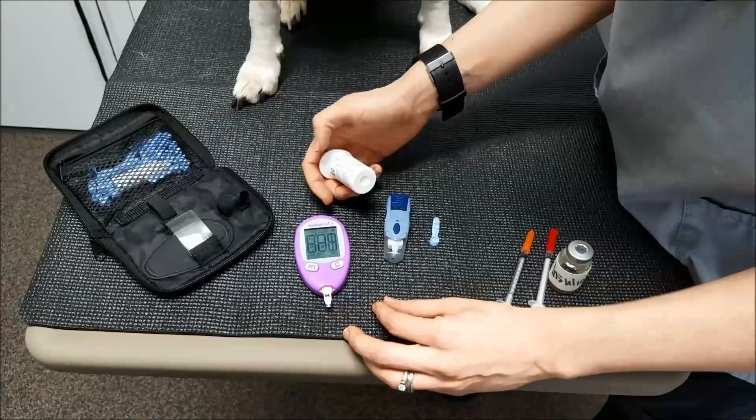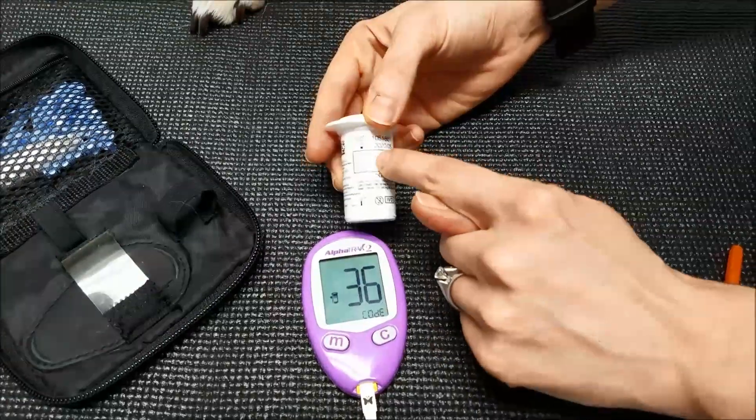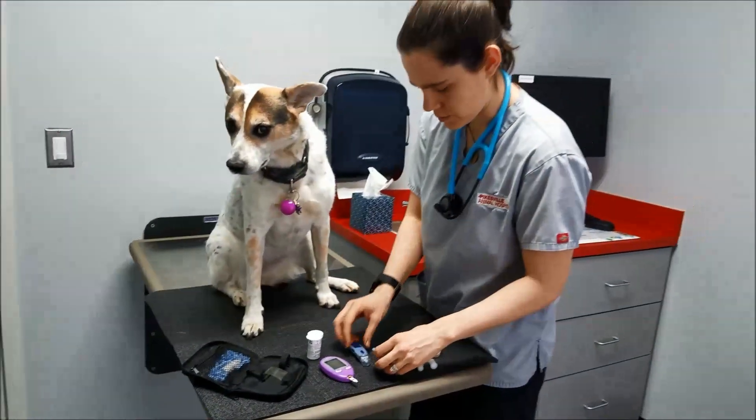To do that you just slip that in there, it'll turn on, and it'll tell you which reading it's at. So it's 36 — that's for dogs, so we're good. I'm gonna pull it out because we're not quite ready to get blood on that strip yet.